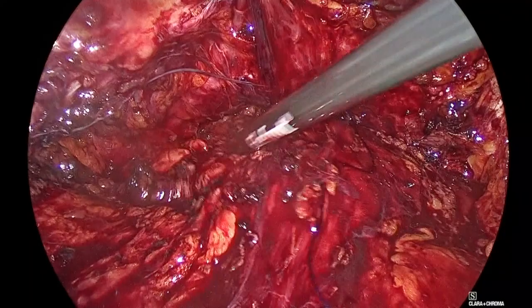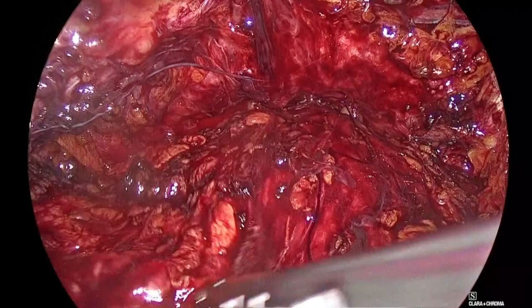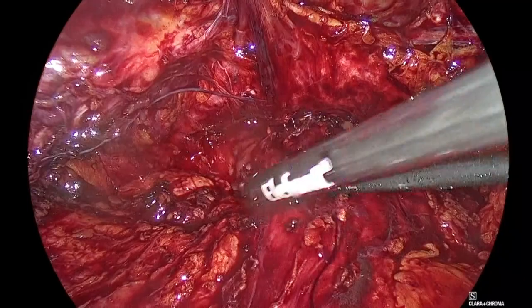And we never irrigate with a syringe here after we finish the procedure. We always increase the IVs and give some Lasix. And this cleans the whole thing. Yes, no? Good.